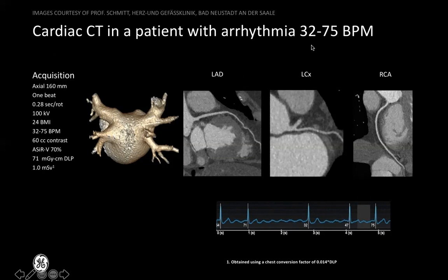Patients who have this high variability are usually in atrial fibrillation. The interesting thing about atrial fibrillation is the atrium itself doesn't really move that much, so it stays in kind of a fixed position. It inflates a bit, and when the ventricle fills, it drops in volume. But for many of these patients, the heart is pretty stationary up at the atrial level.